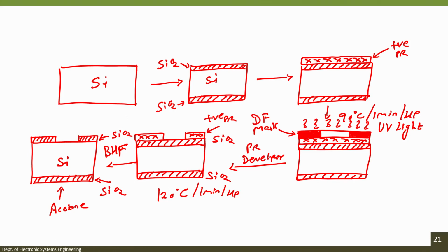Now, after this I will dip this wafer in potassium hydroxide at 80 degree centigrade. When I do this, what will happen? I will have a pit, right. This pit should be equivalent to the height of the bump that we want. So, now you understand this much process.